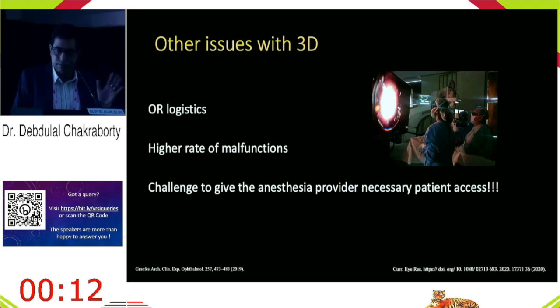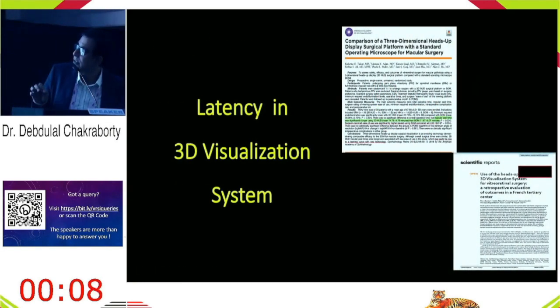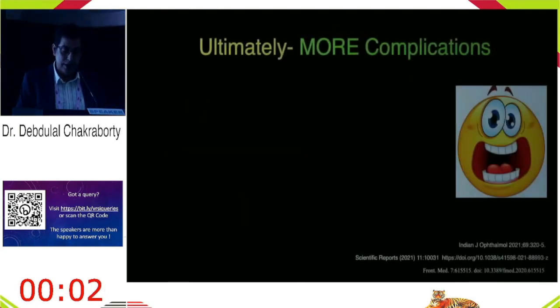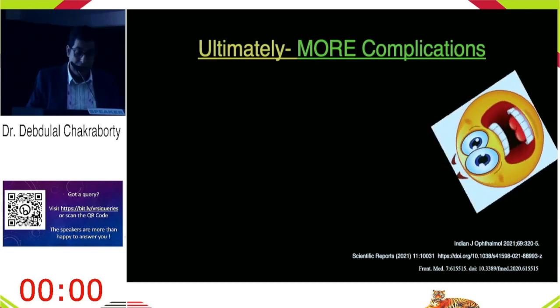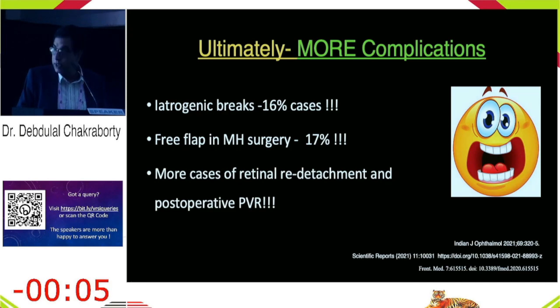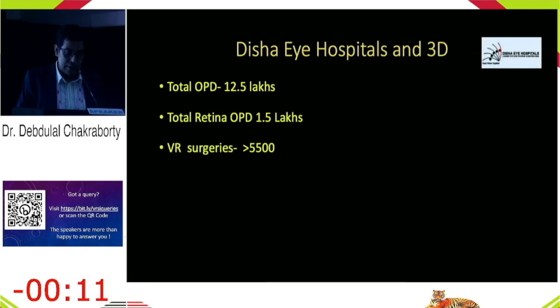Now this is terrible. So probably what takes the cake is latency in 3D visualization. And ultimately what all this does is you have more complications, significant iatrogenic breaks, pre-flaps in macular hole surgeries, and more cases of retinal redetachment and postoperative PVR. So these are the limitations of this technology, also the cost of the device.